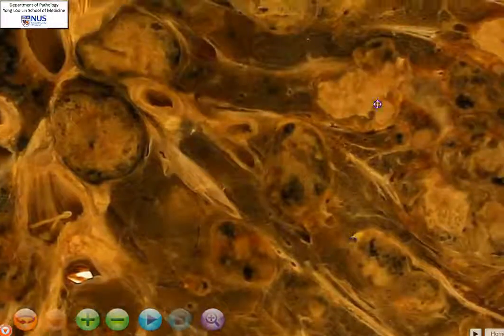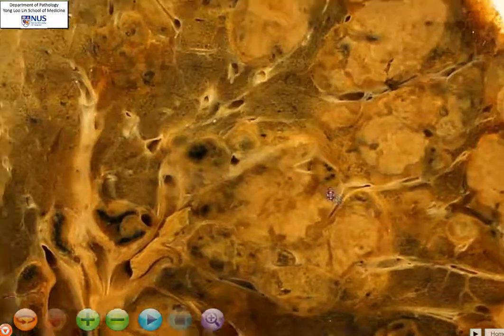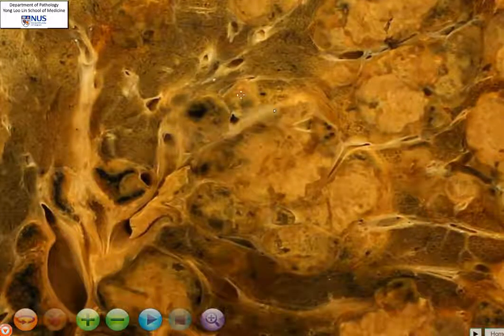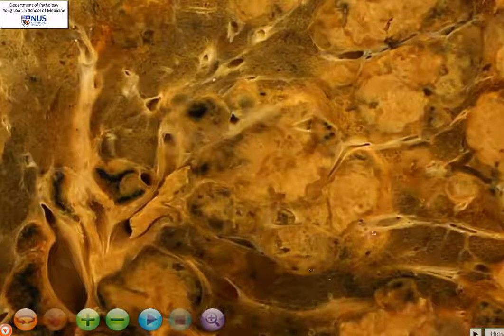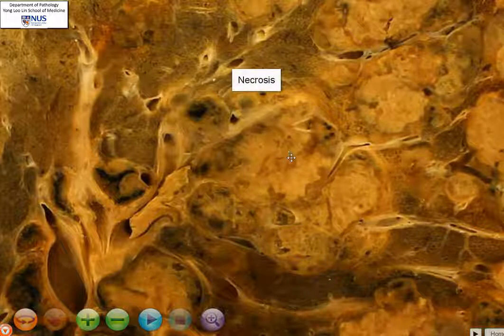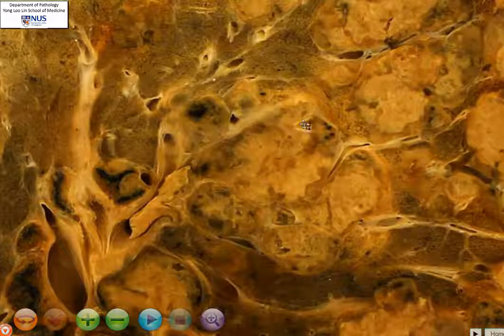Now as we move around, let's focus on one particular mass. We can see here that there is a very irregular, fleshy-appearing mass, but in the more central regions there are these geographic, almost yellowish pale areas.